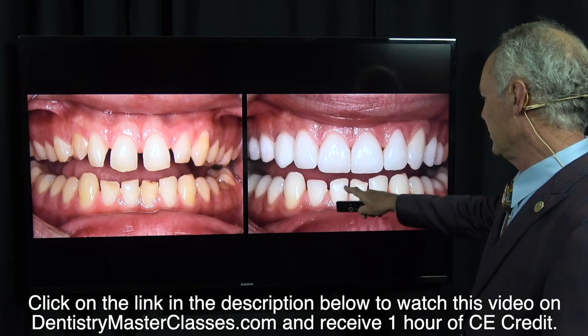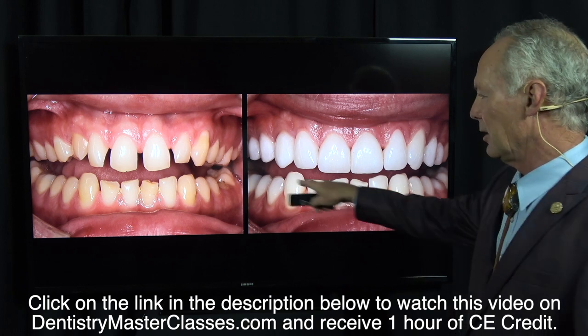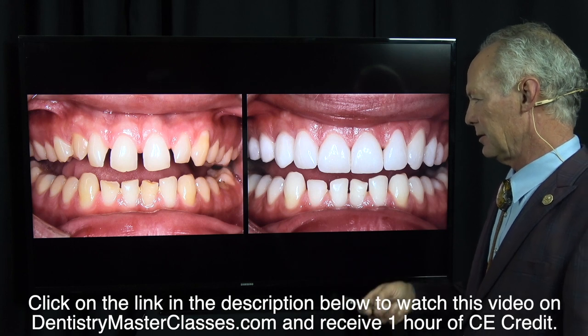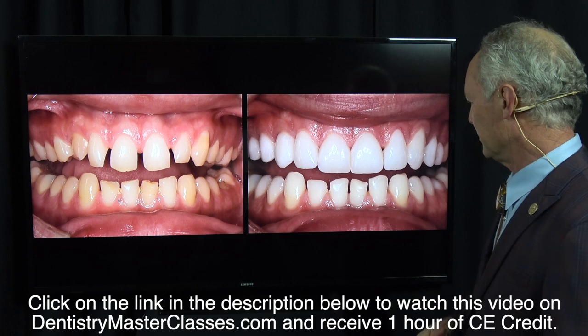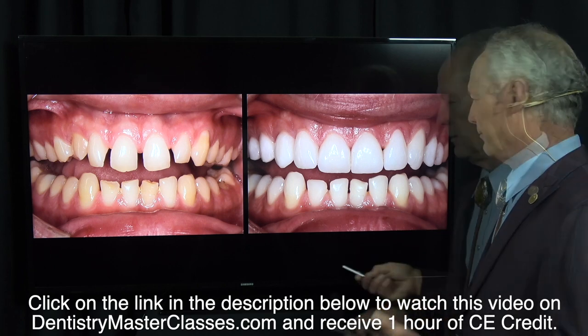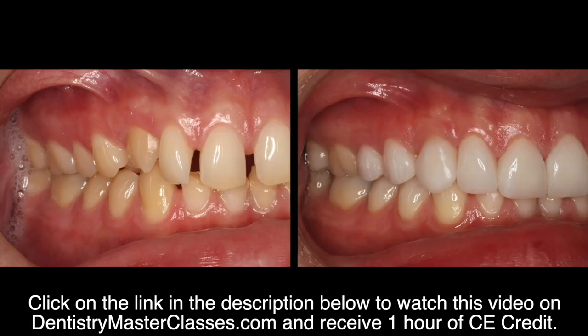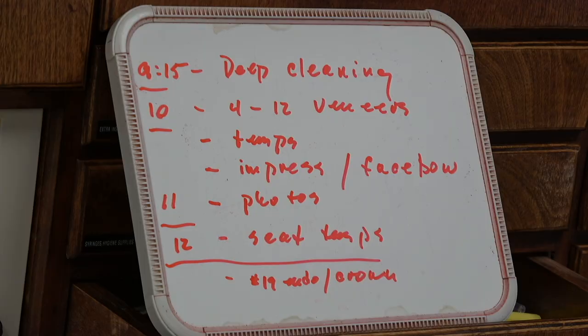Now on the bottom, lower teeth, we've just bleached them and placed some bonded composite on the incisal edge. At some point, we're going to veneer the lower anterior teeth back to the bicuspids, but from a financial standpoint, that was not something we did at this phase one. Now this is the upper left, before and after, upper right, incisal.